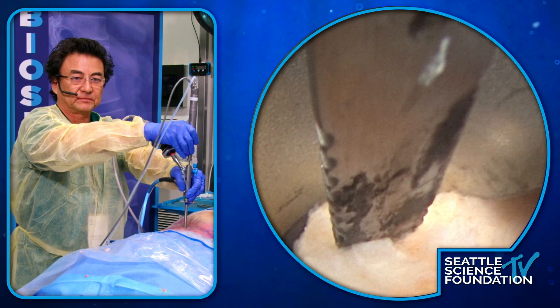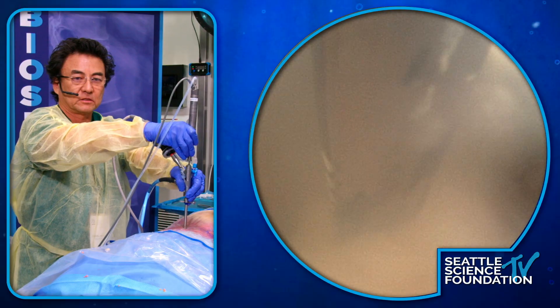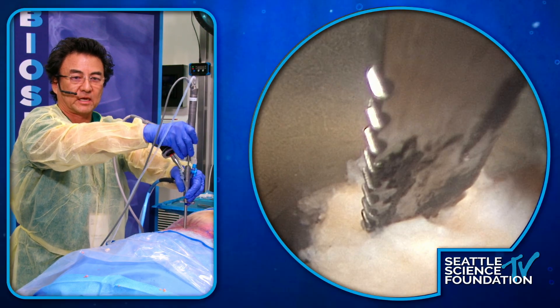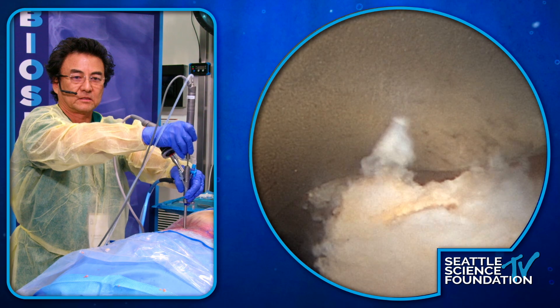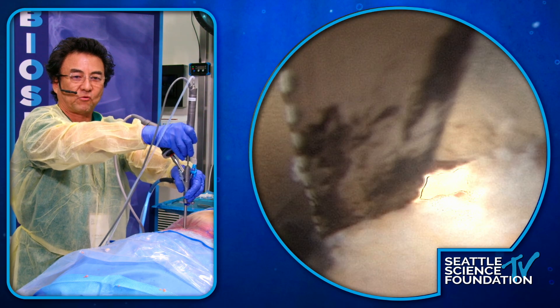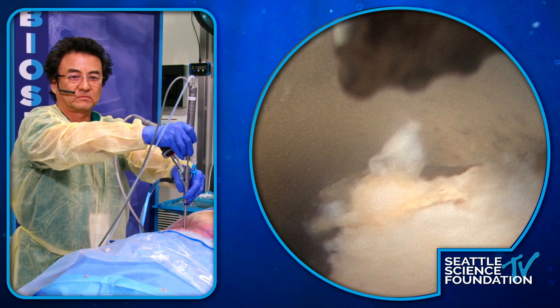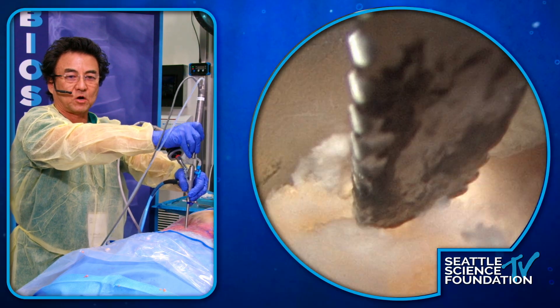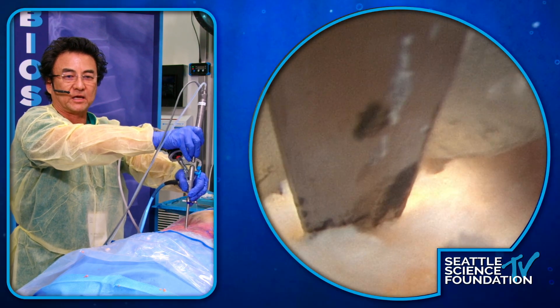See, it's more like a blade. So now I can just create a line — it's like using long chopsticks — and I can just keep going all along whatever line I wanted to create.